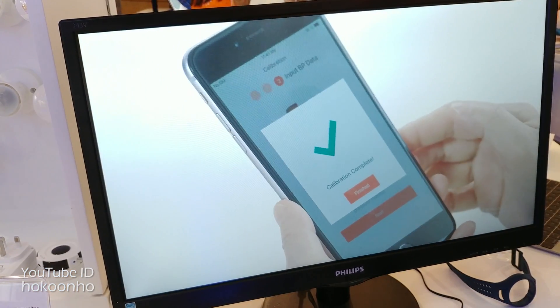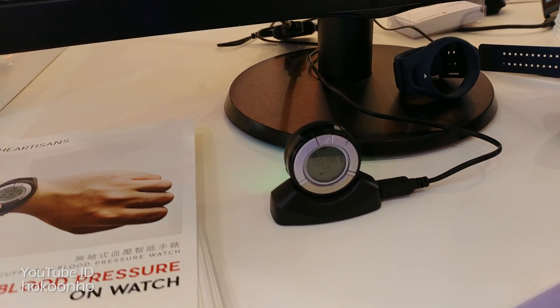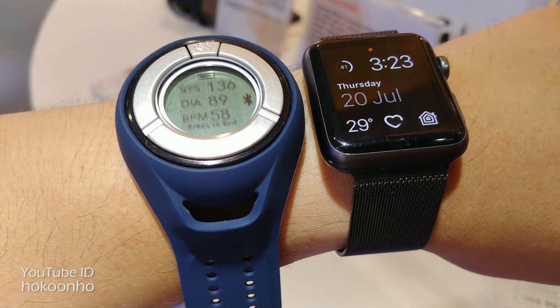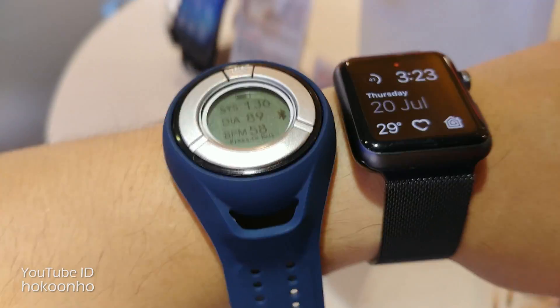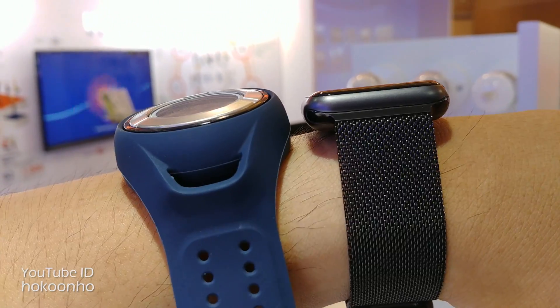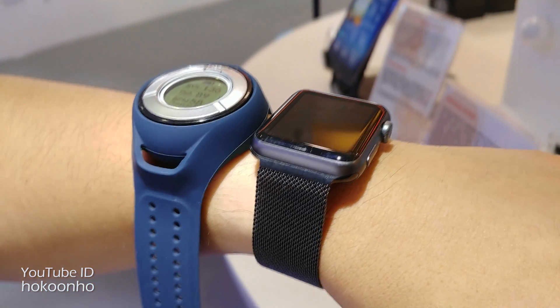Unfortunately, the mobile app is not available here, so I have to wait until they release the mobile app. You can easily take out the watch body and put it into the charging dock. Here is the size comparison of the Apple Watch and this Hardison watch. It is a bit thicker than the Apple Watch, but acceptable.